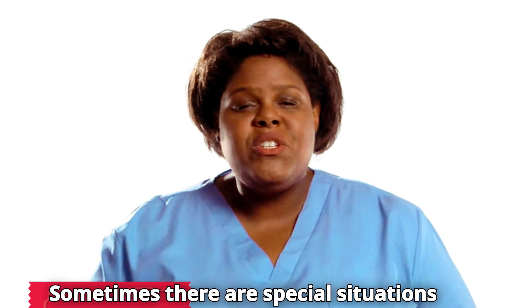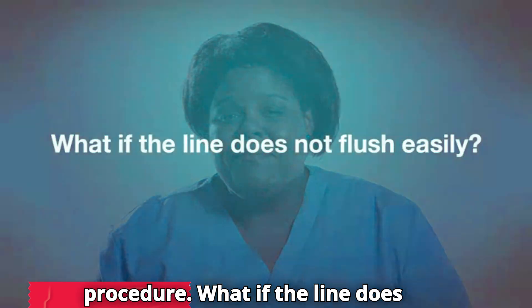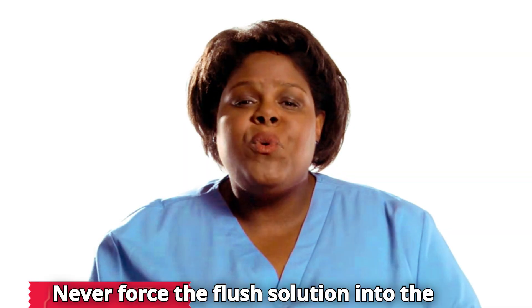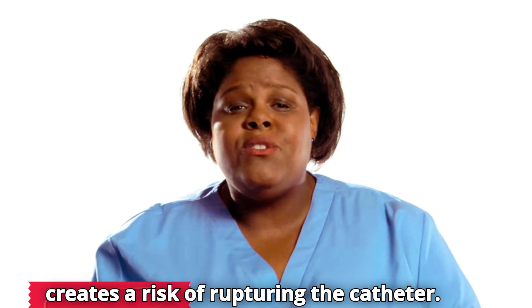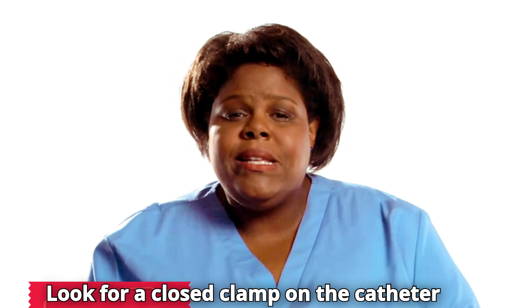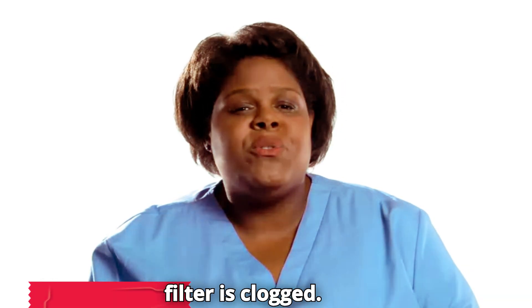What if the line does not flush easily? Never force the flush solution into the venous access device if you feel resistance. Forcing fluids creates a risk of rupturing the catheter. Look for a closed clamp on the catheter or tubing and check to see if an inline filter is clogged.